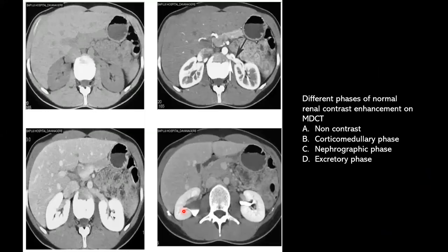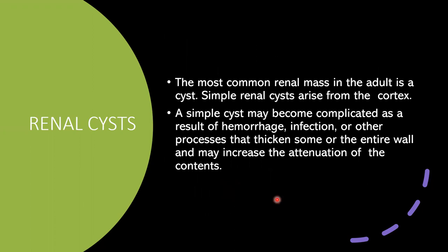These are the normal different phases of renal contrast enhancement on MDCT: non-contrast enhancement, corticomedullary phase enhancement, nephrogenic phase enhancement, and excretory phase enhancement.